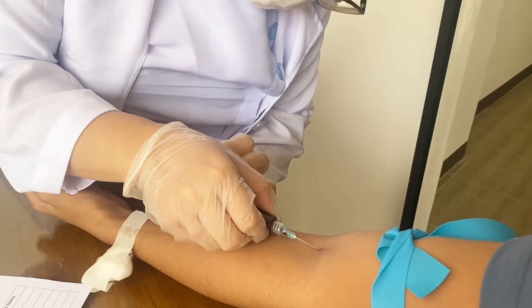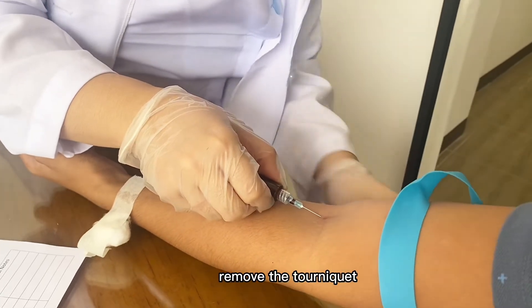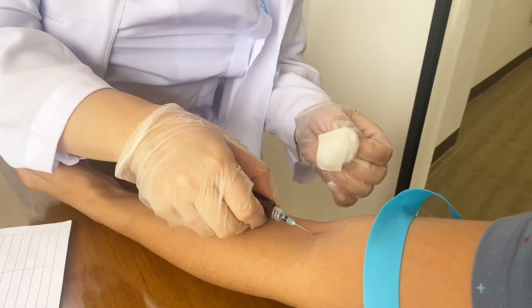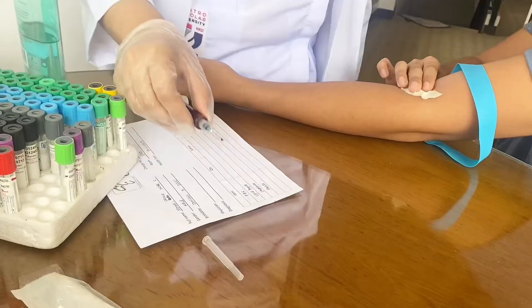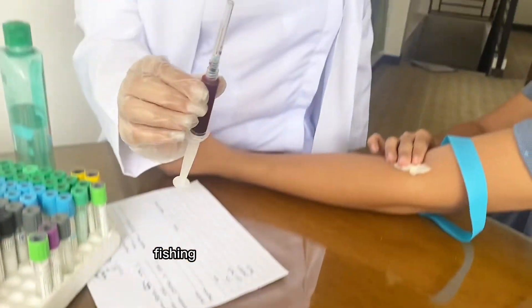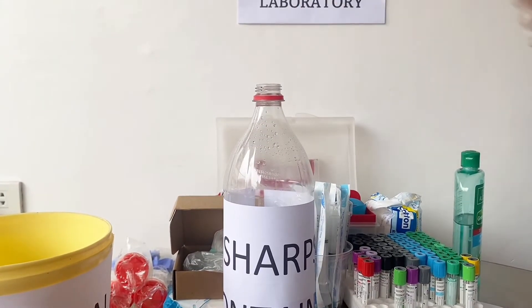Once sufficient blood has been collected, release the tourniquet before withdrawing the needle. Withdraw the needle gently and apply gentle pressure to the site with a clean, dry cotton ball. Use the fishing technique to prevent accidental needle prick. Discard the needle to the sharps container.